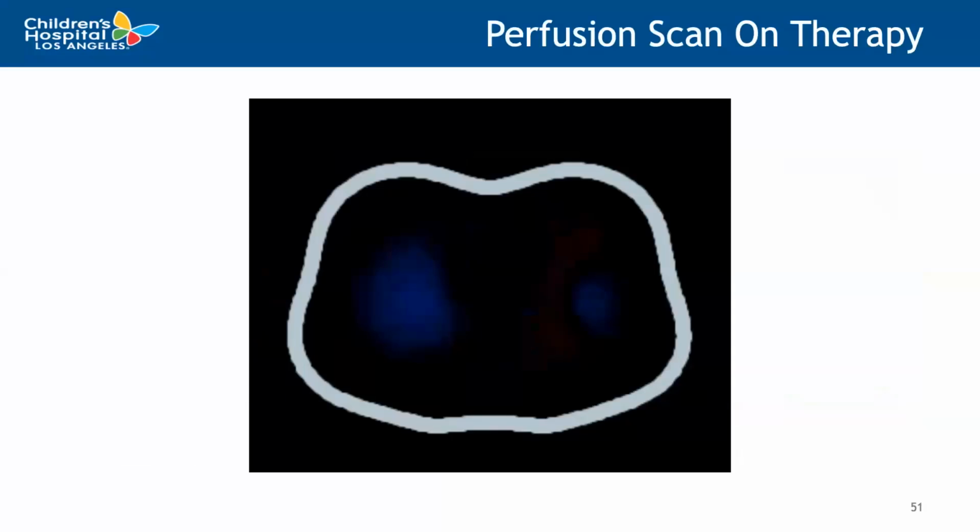Unfortunately, we couldn't use the pulsatility feature in this patient, and it was for a pretty interesting physiologic phenomenon. Once patients with severe pulmonary hypertension are initiated on therapy, those therapies tend to selectively dilate large arteries. A lot of that pulsatile energy is lost in those large arteries and not transmitted out to the peripheral vasculature. So the pulsatility image for this patient showed no perfusion in the lungs, which we were able to find out later was not the case, but it was just a limitation of the technology. This is called the Windkessel effect, and in talking to our pulmonary hypertension experts, this is a known phenomenon.